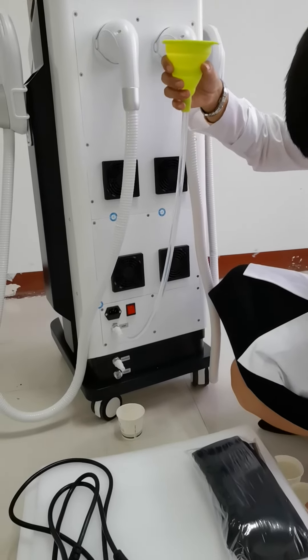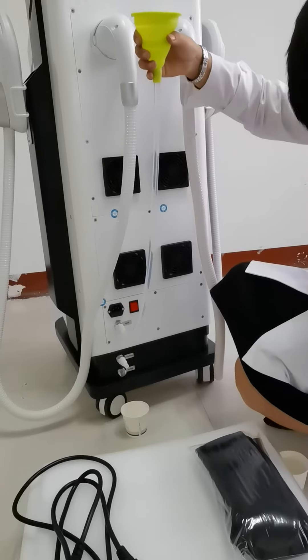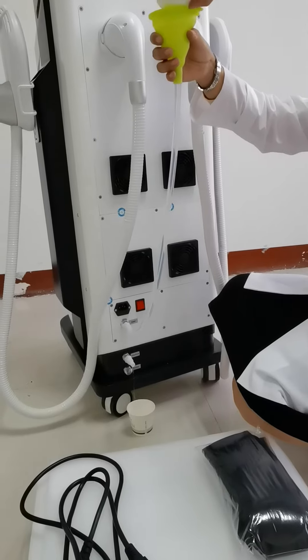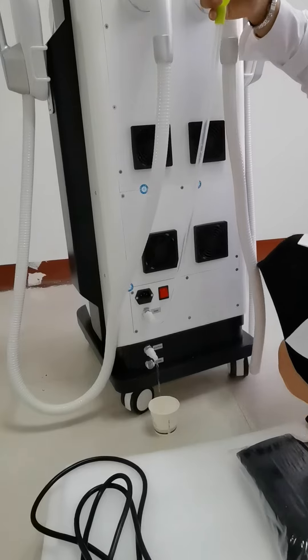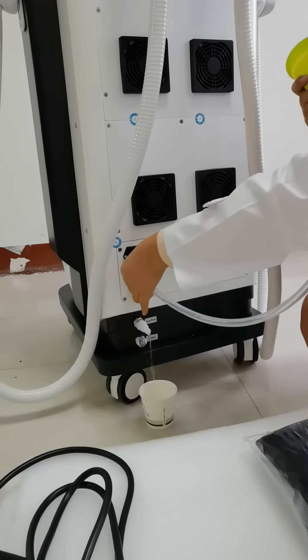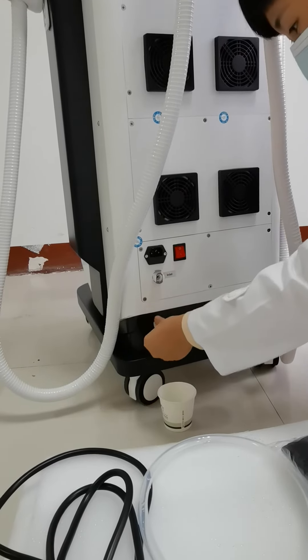If the water tank is full, there will be water coming from the overflow. Now we can take off the water tank connector and also take off this.